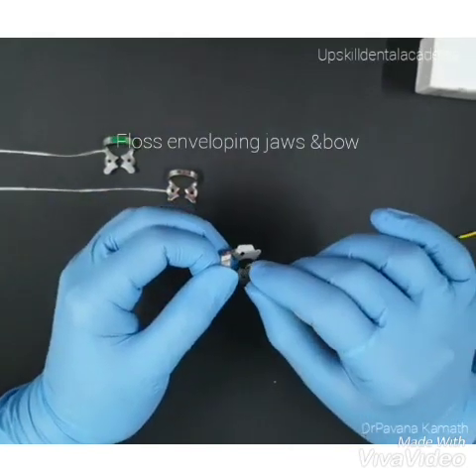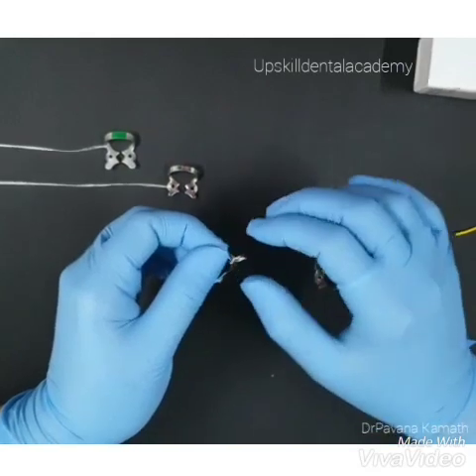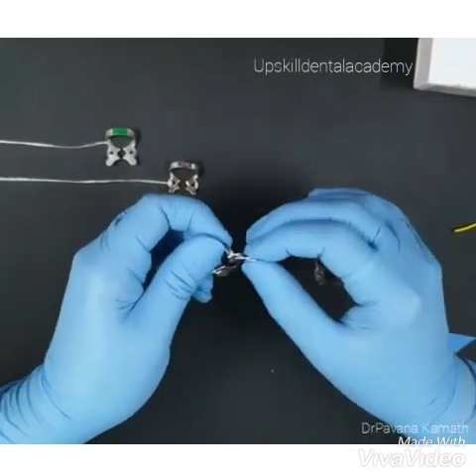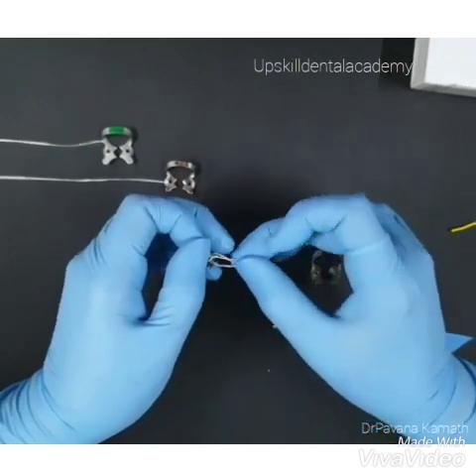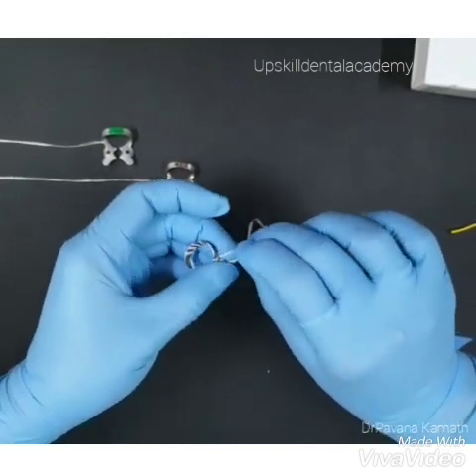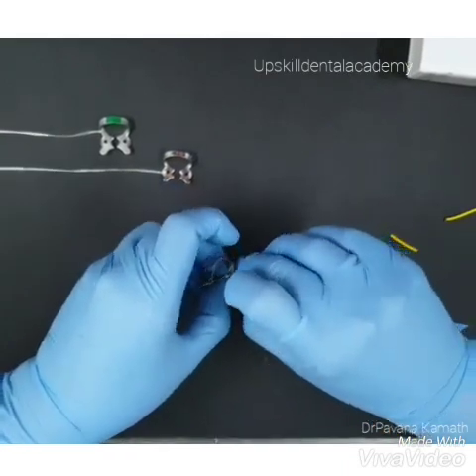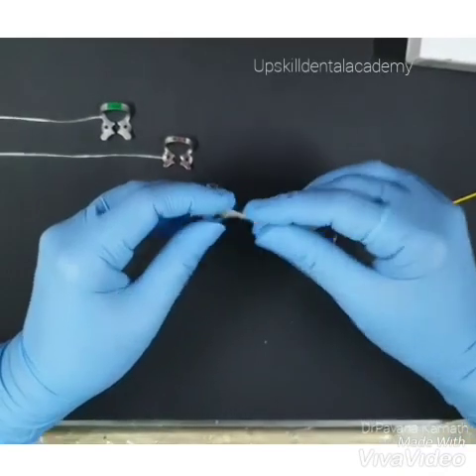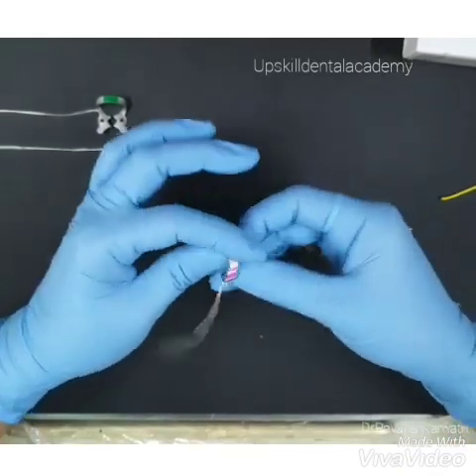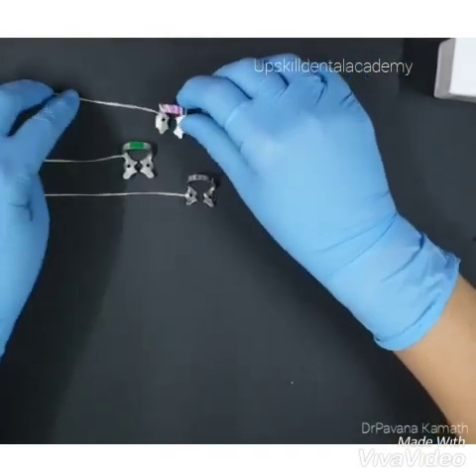A knot is preferred. Tying the floss on the clamp is preferably done before the trial of the clamp in the patient's mouth to keep it secure.